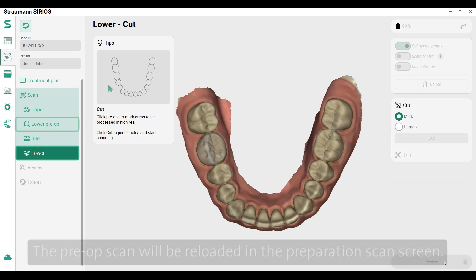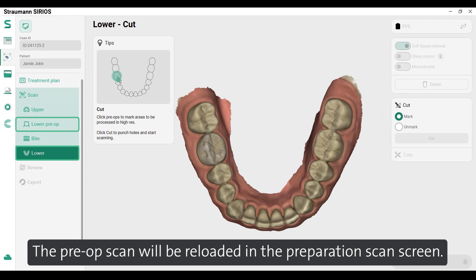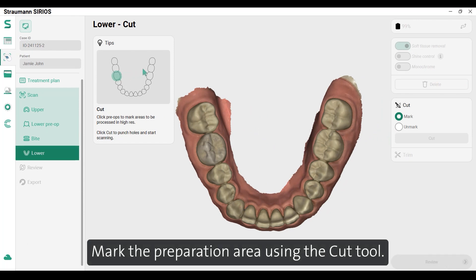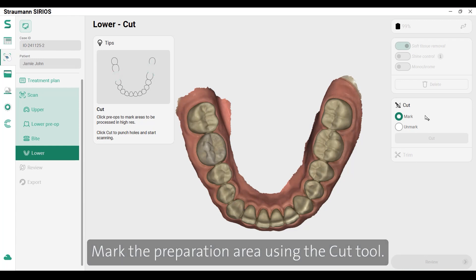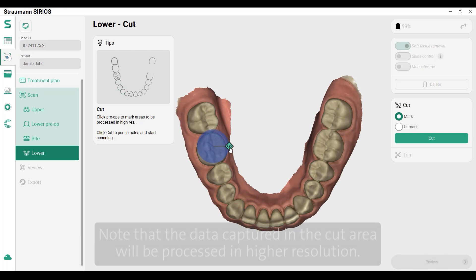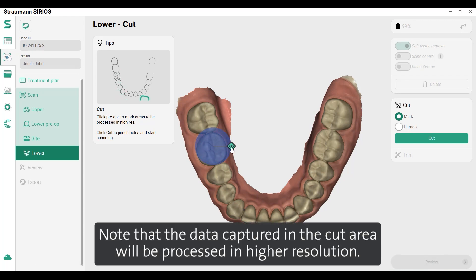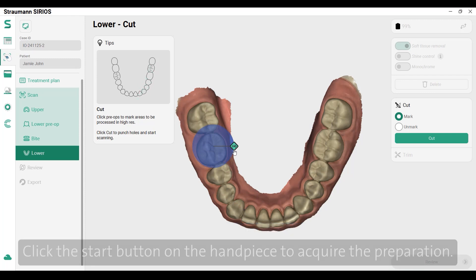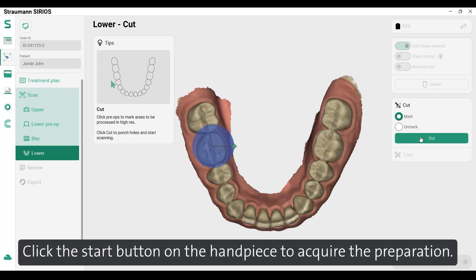The pre-op scan will be reloaded in the preparation scan screen. Mark the preparation area using the cut tool. You can enlarge the mark cylinder by using the green handle. Note that the data captured in the cut area will be processed in higher resolution. Click the start button on the handpiece to acquire the preparation.